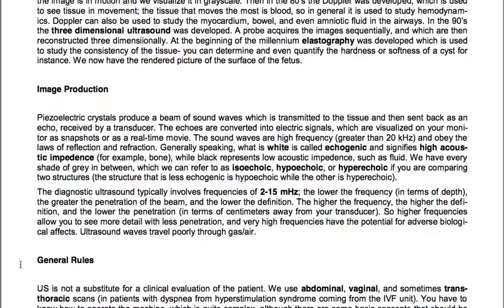Image production is done as follows. Piezoelectric crystals produce a beam of sound waves which is transmitted to the tissue and then sent back as an echo received by a transducer. The echoes are converted into electric signals which are visualized on your monitor as snapshots or as a real-time movie. Sound waves are high frequency, greater than 20 kHz, and obey the laws of reflection and refraction.